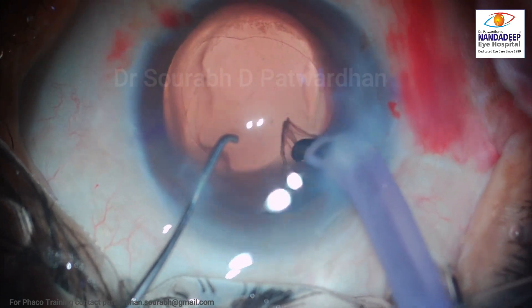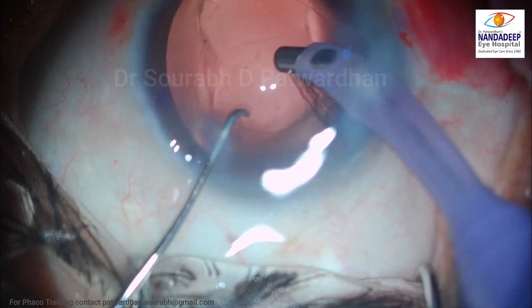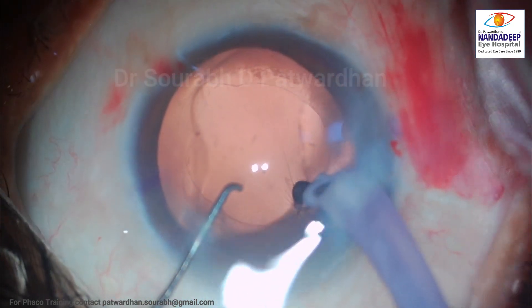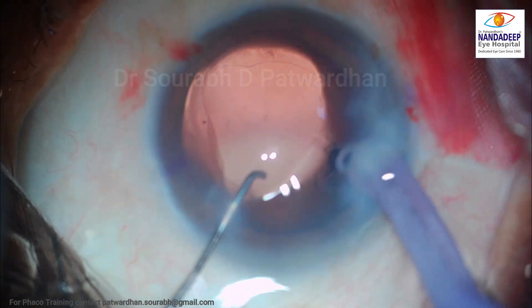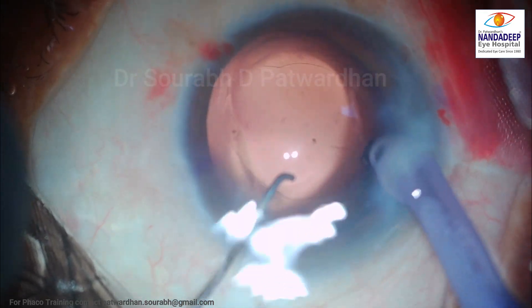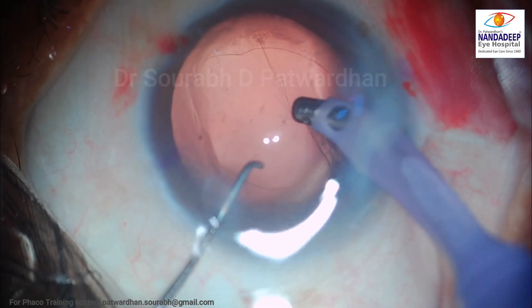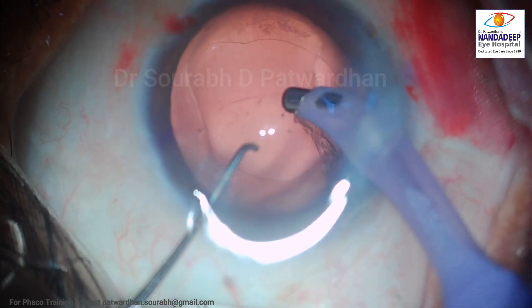As I reach the sub-incisional cortex, I find that because of the redundancy of the posterior capsule, the IA probe is holding it quite often. And I am not able to loosen the sub-incisional cortex here despite some efforts. I don't want to complicate this case by rupturing the posterior capsule. You can see that I keep holding the posterior capsule and I don't want it to be ruptured.